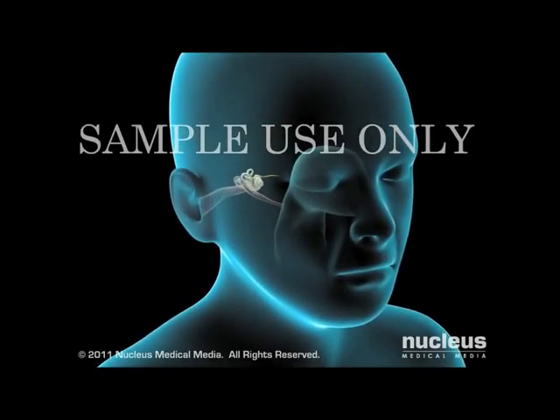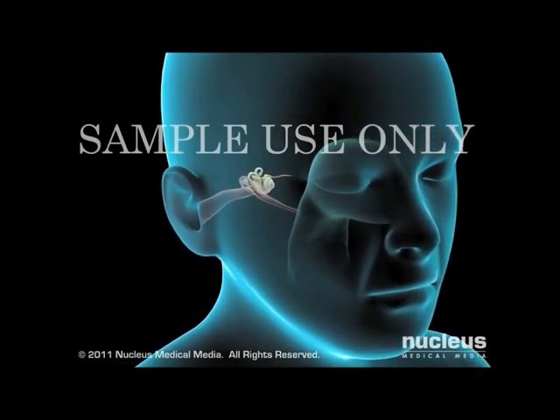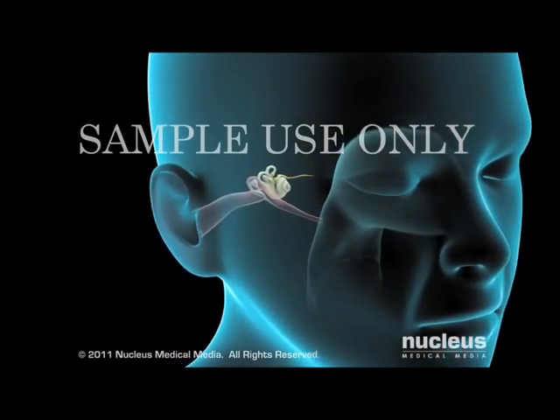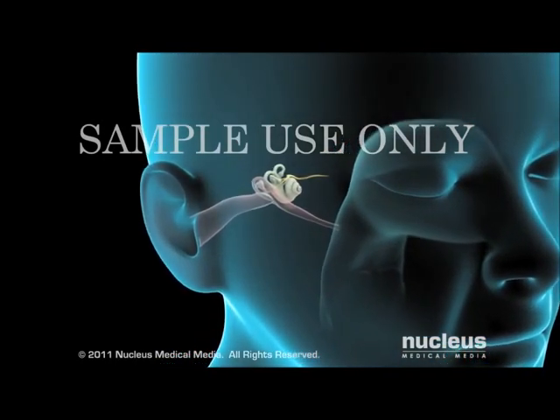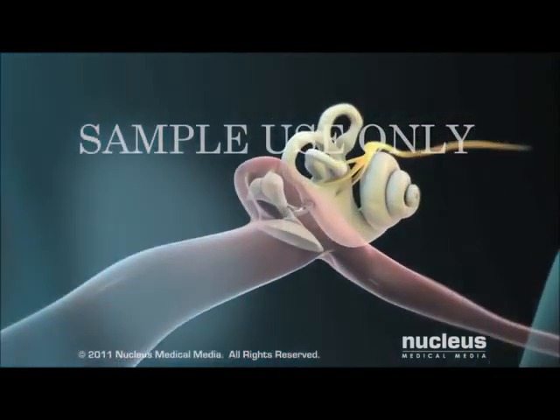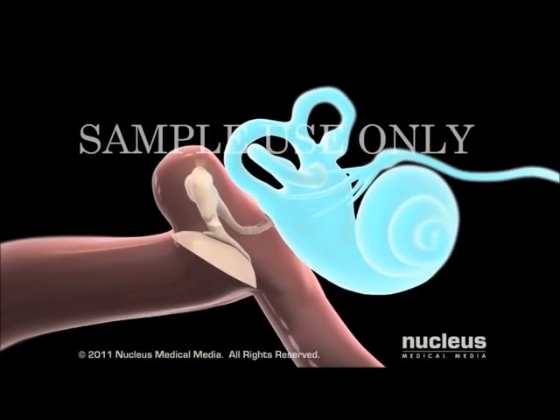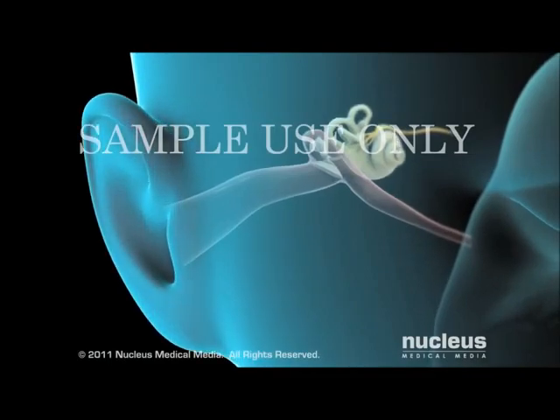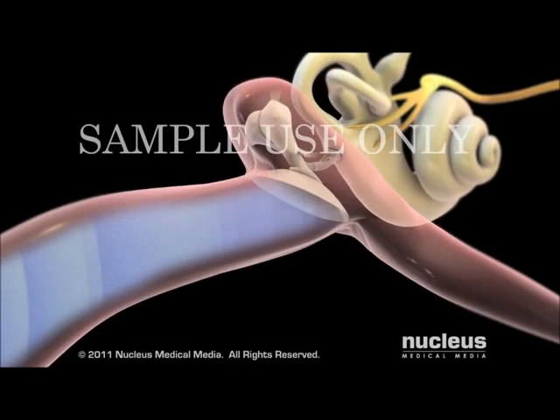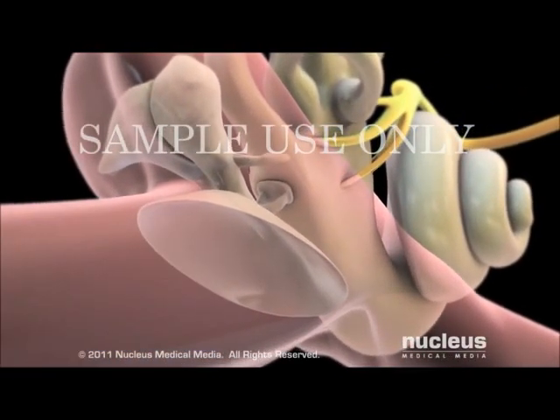A myringotomy, also known as a tympanostomy or tympanotomy, is a surgical procedure to remove fluid in the middle ear and re-establish equal air pressure on both sides of the eardrum. The ear consists of three main parts: the outer ear, the middle ear, and the inner ear. The outer ear includes the pinna, which collects sound waves, and the ear canal, which transports sound waves to the eardrum, a paper-thin layer of tissue separating the outer and middle ear.